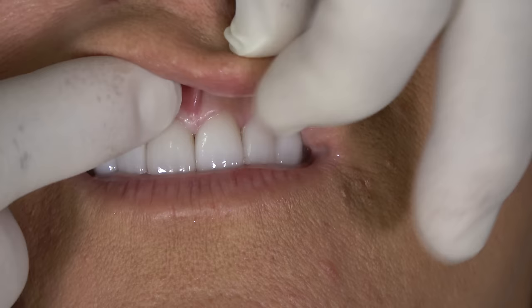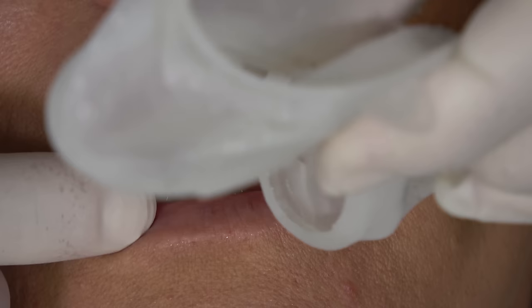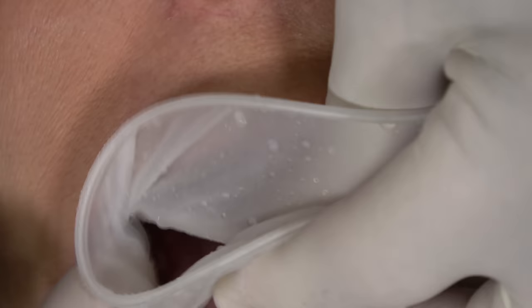We gave her a local injection, just used about a quarter of a carpule of lidocaine. I like to use these Opturgates, available from Ivoclar. It's a non-latex, flexible cheek retractor.